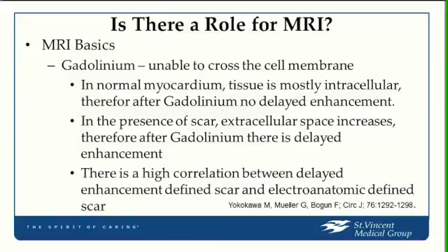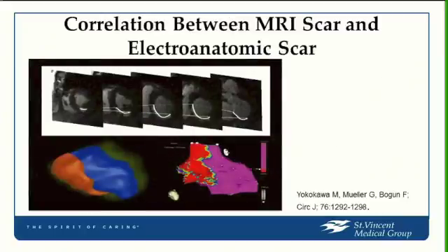So if we put a catheter in and we see that there's no voltage coming from a particular area, that area is dead. And it turns out that there's a good correlation between areas that are not making electrical activity and areas that show high delayed enhancement.